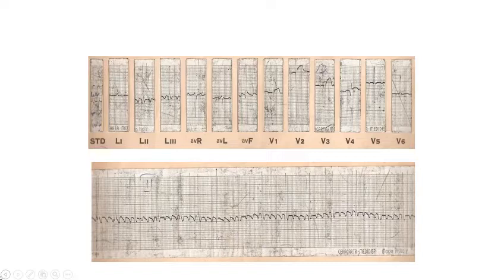Usually it goes up and up. There are flutter waves, depolarization and repolarization waves, while in atrial tachycardia you will be able to see an isoelectric line in between. So in an arrhythmia strip, if you see a bit of an isoelectric interval, then you should go for atrial tachycardia. And if there is no isoelectric interval at all, and it's all going up and down, then that goes for atrial flutter. Okay. What else is there in this patient?